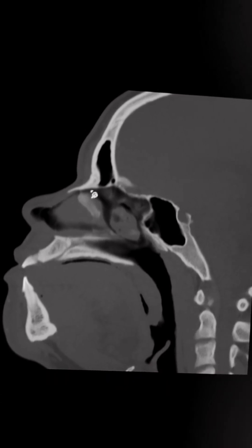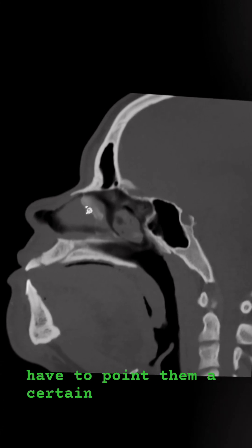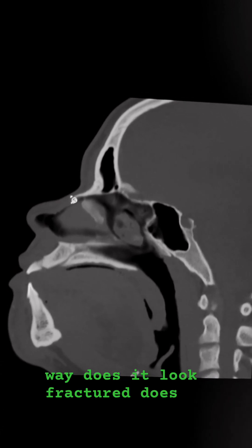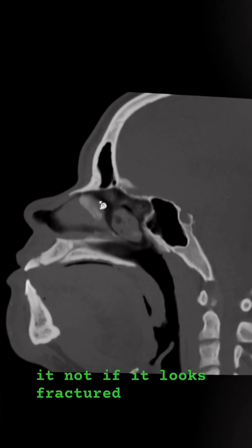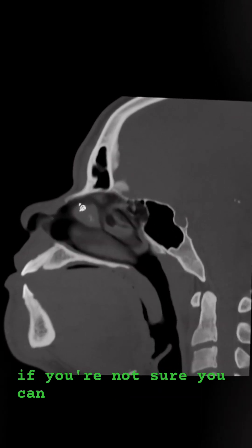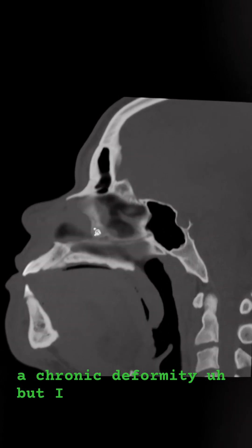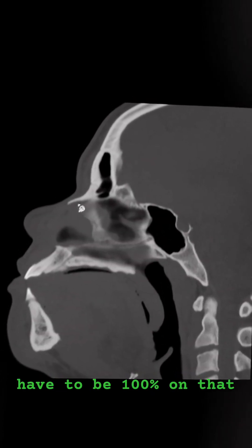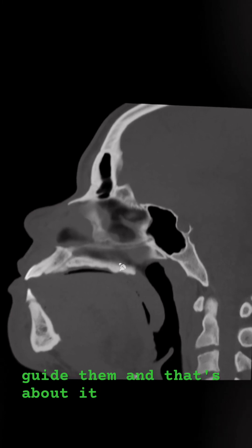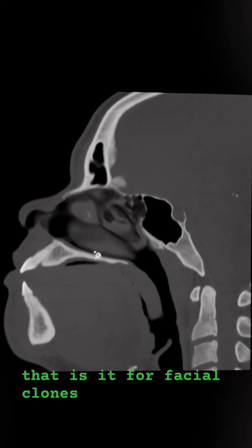Nasal bones — you certainly look at them, but you don't have to be a hundred percent right. You just have to point them in a certain direction. Does it look fractured or not? If it looks fractured, you say so. Sometimes you know for sure; if you're not sure, you can say that. Sometimes it's a chronic deformity. After years of doing this, you realize you don't have to be a hundred percent on nasal bones — you just have to guide them. And that's it for facial bones.